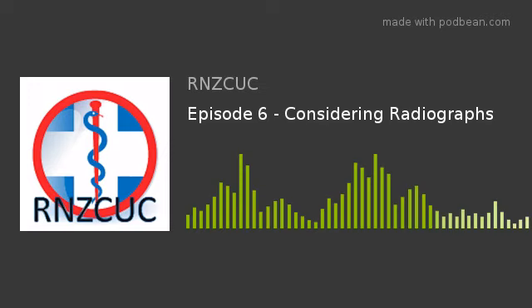So the swimmer's view is an alternative view which is done if you can't visualize C7T1. Our first point of call, if you can't see C7T1 on a lateral, is to try the lateral again with the patient weight bearing, because it depresses the shoulders and sometimes you're able to better visualize the lower C-spine. If that doesn't work, then you'd go on to your swimmer's lateral.